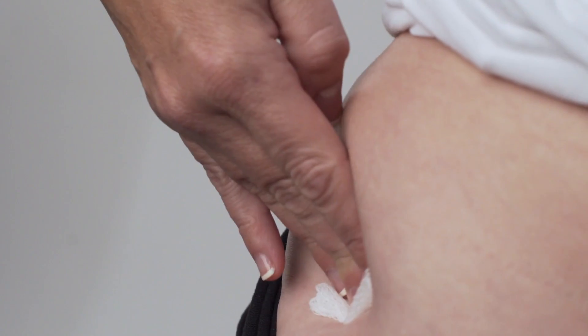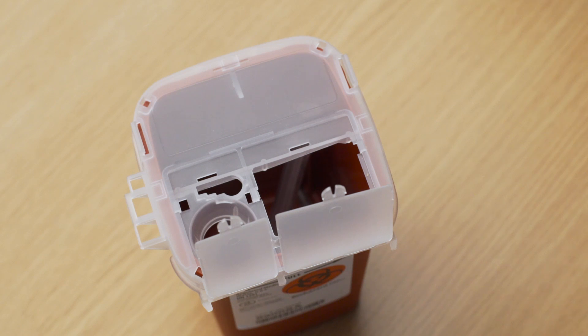Gently withdraw the needle and apply pressure to the injection site with a sterile gauze pad. If needed, apply a band-aid. Once your injection is complete, dispose of the used needle and syringe in your safety container.